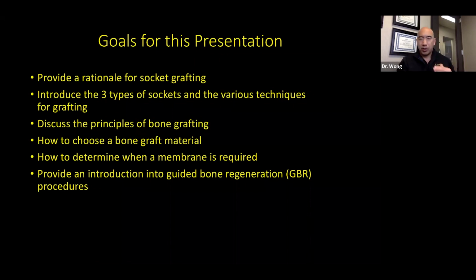That's probably the most underutilized technique or procedure that I see in implant dentistry: people take teeth out and they don't think far enough ahead to graft the socket and prepare the site for an implant. Usually they treat the toothache by just taking the tooth out, and then later they're thinking, oh, the patient now wants an implant. So this is just something that we need to talk about.